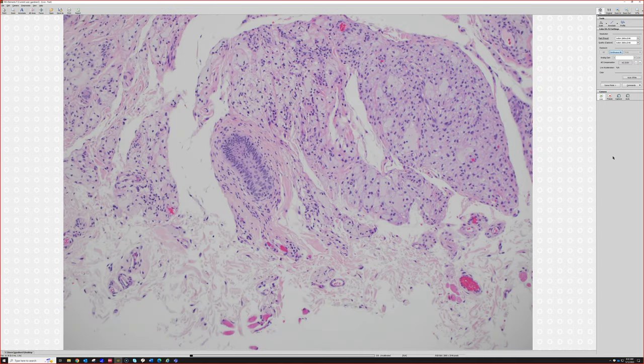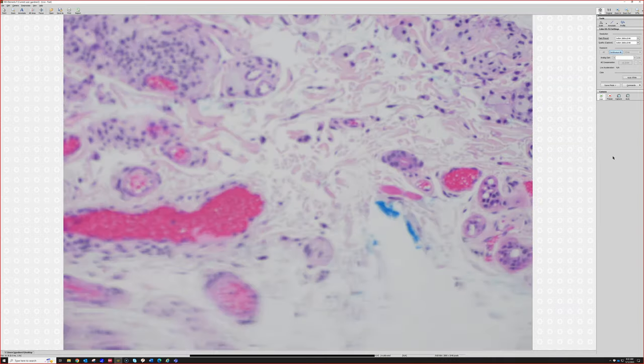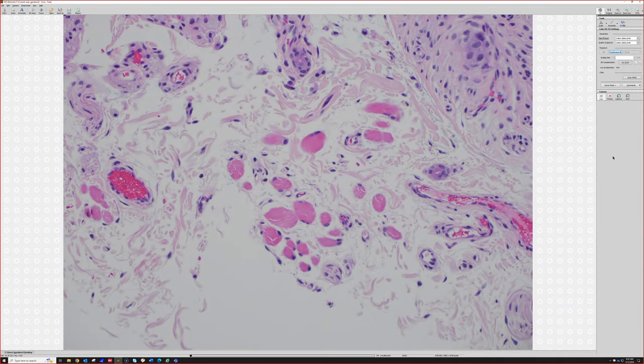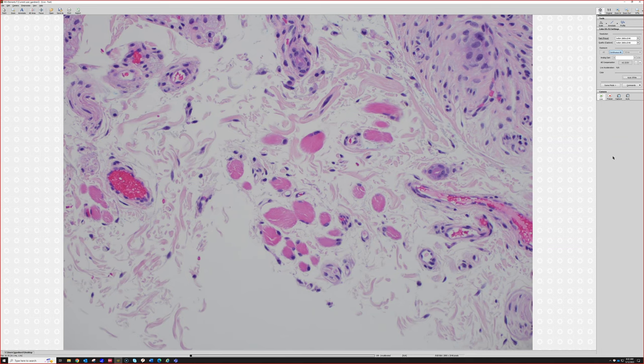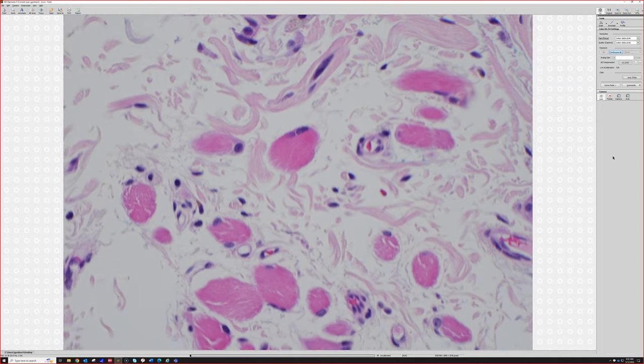Okay, and how can we tell that we're in the eyelid even without being told? Well, number one, we've got skeletal muscle here. How do I know it's skeletal muscle? Well, one, you can see striations if you've got a longitudinal section, but if you've got a cross section of it, look where the nuclei are. They're on the outside of each individual fiber. Remember, multiple peripheral nuclei around a fiber, that's what skeletal muscle does. And then if you look closer, you can see striations sometimes.